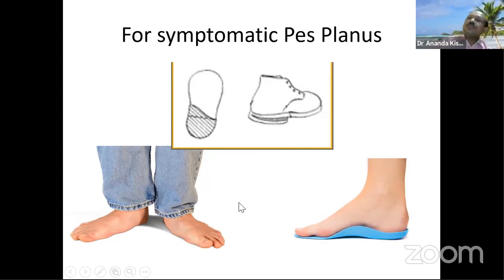Another device is usually for the flat foot. Usually flat foot may be congenital, when a very young child usually comes with this. So in that case, the medial arch is very low or maybe absent. In that case, we have to stiffen the medial arch. This is the heel breast. Normally, see the heel breast, and the heel breast is extended up to the base of the first metatarsal or the head of the metatarsal.